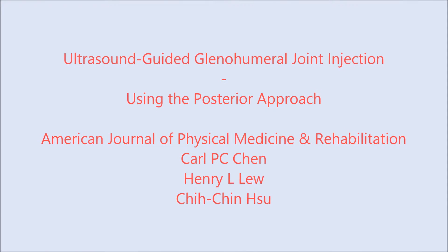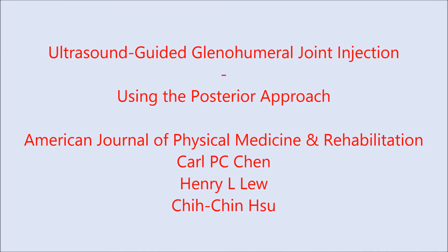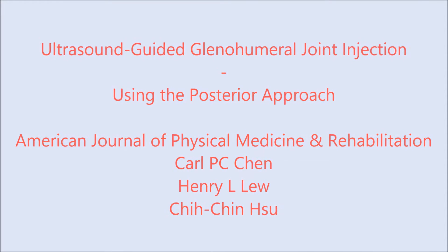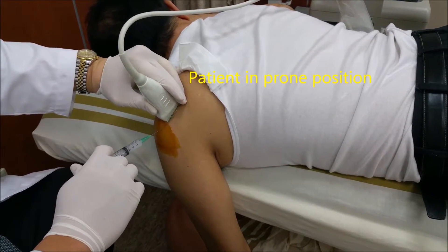This video will demonstrate how the shoulder glenohumeral joint injection is performed. The joint injection can be done through the anterior or the posterior approach. This video will show you how the posterior approach is done.